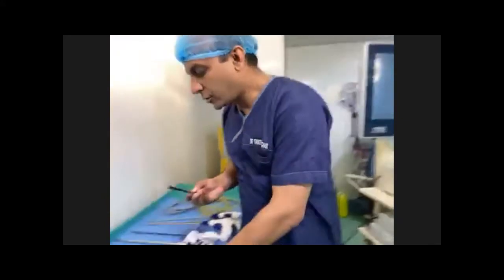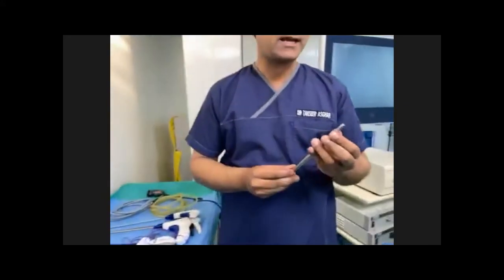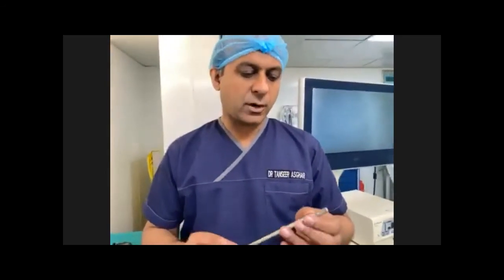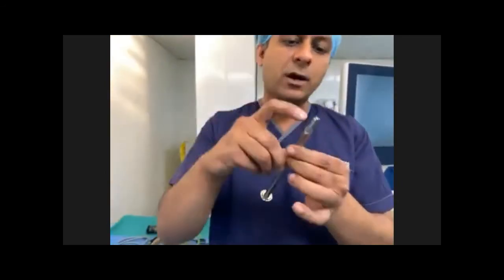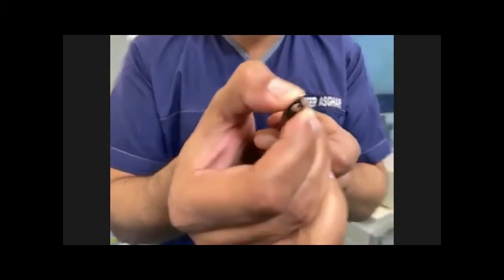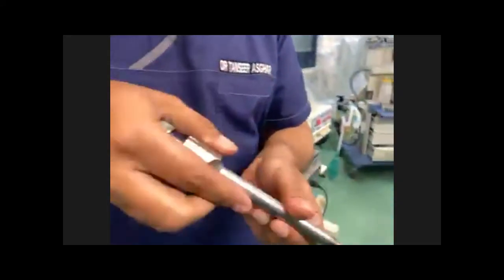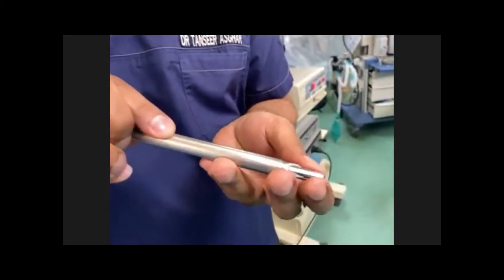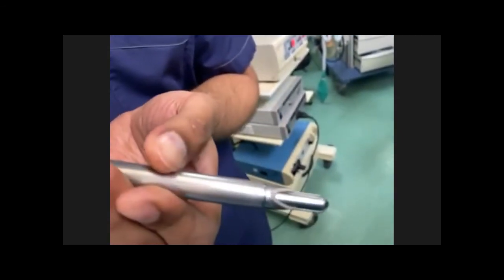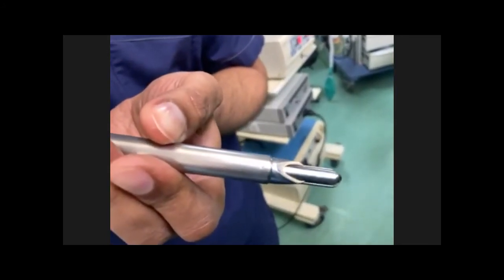So coming on to the trocar first, the trocars are of different types, both disposable and reusable. This is called the safety trocar. You can see there is a safety shield over it and a sharp edge inside it. When you go in, putting it inside the port with a clockwise and anti-clockwise motion, you enter the abdomen through this sharp end, and once you enter the abdomen, the shield comes out. So it saves the viscera from getting damaged. So it is called the safety trocar.